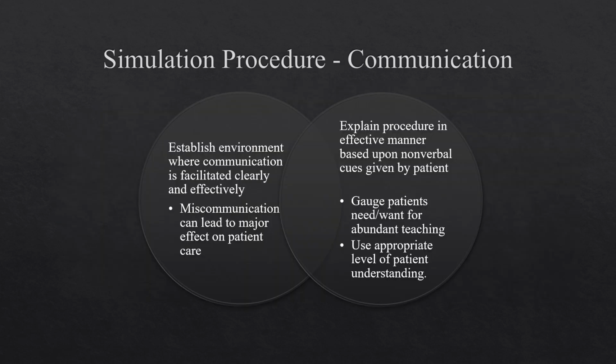Okay, simulation procedures. One of them is communication, the other one is education. One of the main points that radiation therapists must follow during the simulation is communication to reduce anxiety during the treatment or during the simulation. By that, we explain, illustrate, and present anything they want to make them feel more comfortable. Establish an environment where communication is facilitated clearly and effectively. Miscommunication can have a major effect on patient care.